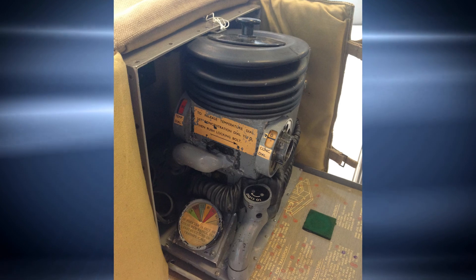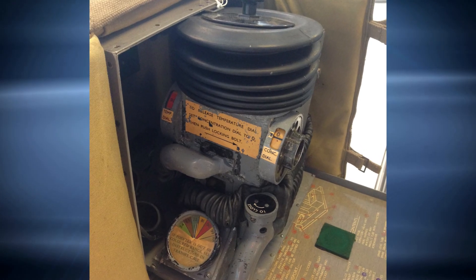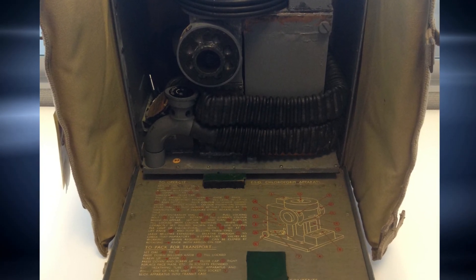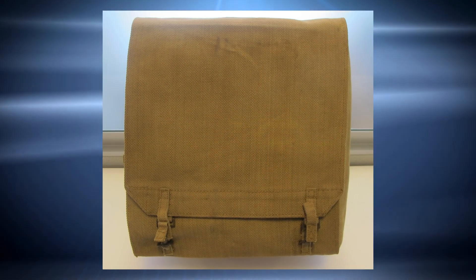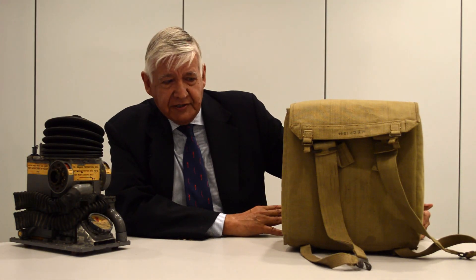So here we have the carrying bag for this ESO inhaler. It's covered by this classic army-colored pack, and when you shut that up and close it off, around the back there are straps. This device was carried by paratroopers — they either carried it on their backs or on their chests and parachuted with it into the war zone.